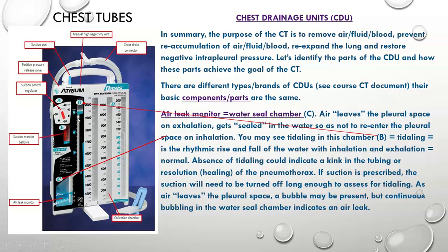The other thing you might see, and that's this chamber here, it's connected to the water seal, is that if the patient's not on suction, you will see what's known as tidaling. In other words, this blue water will go up and down, like the tide in an ocean. And it does that in response to the patient's breathing pattern.